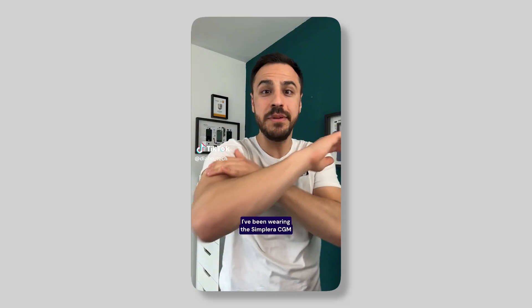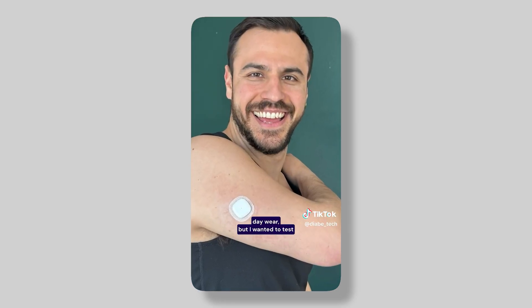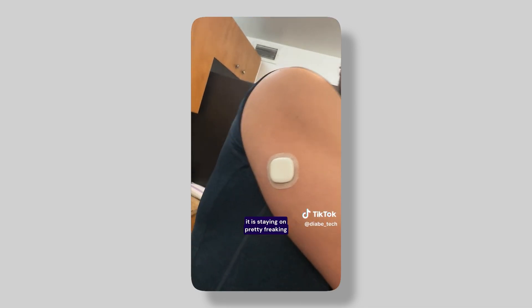I've worn the Simplera for much longer — I think I went as long as 15 days just to test it out. On social media I made a video using a dummy Simplera; it didn't have a sensor, but it was the same adhesive and that stayed on for about 15 days. So it stays on well, but even though it will stick on for that long, you can only use it for those seven days.